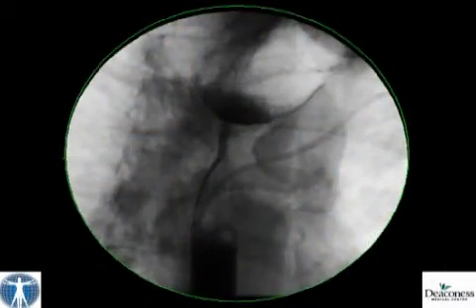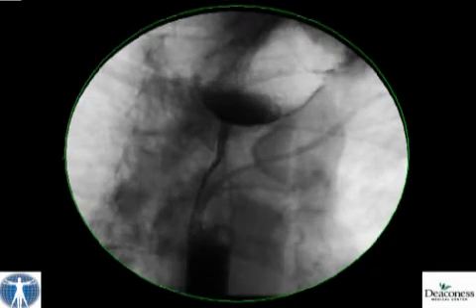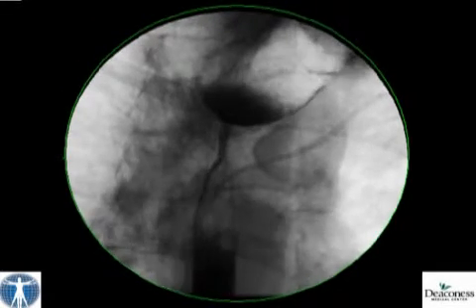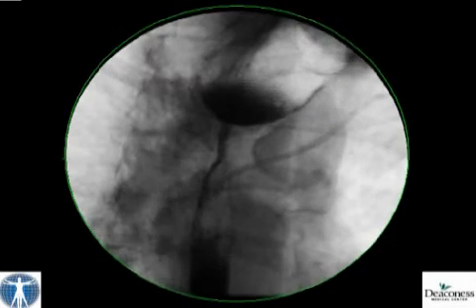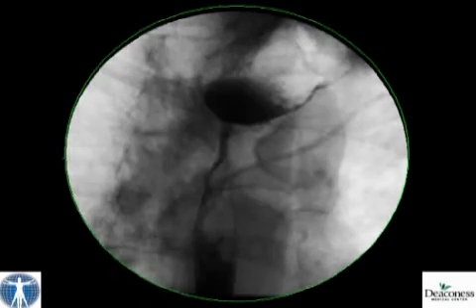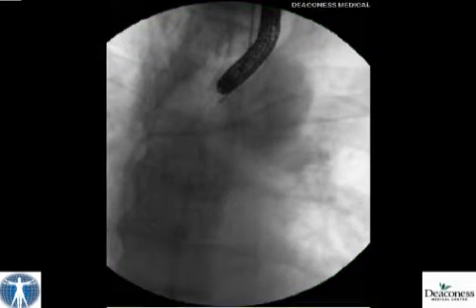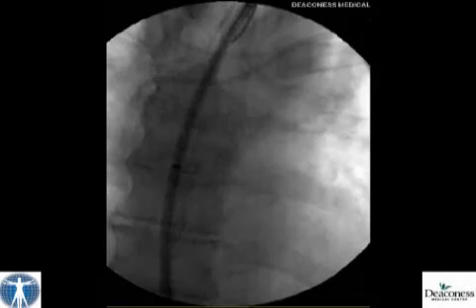The follow-up barium esophagogram shows a good functional result, and the patient commented how relieved he was that he could swallow again and did not have to spit into a cup all the time. He tried a liquid diet and tolerated it well. To consolidate the results, a 10 cm long ultraflex esophageal stent was placed.